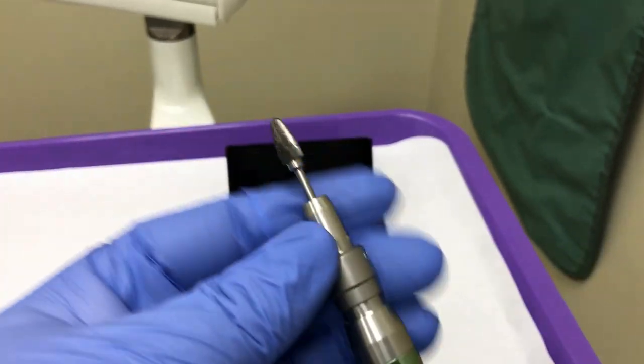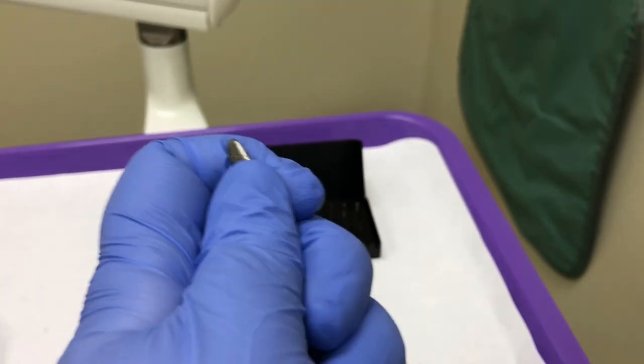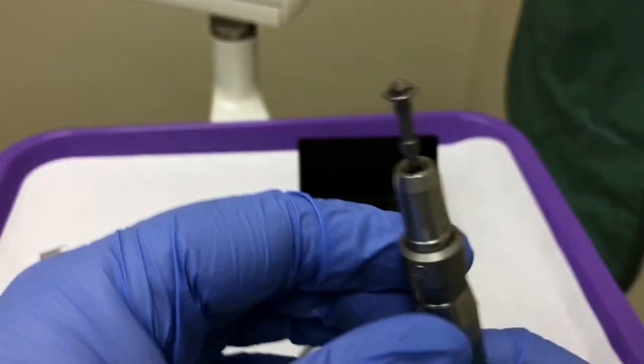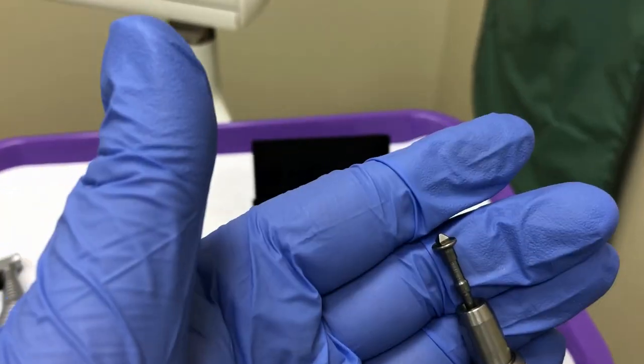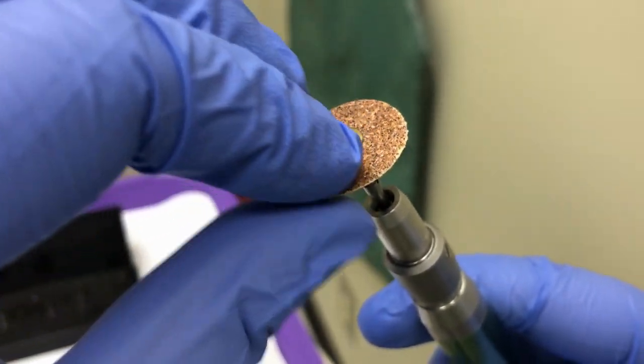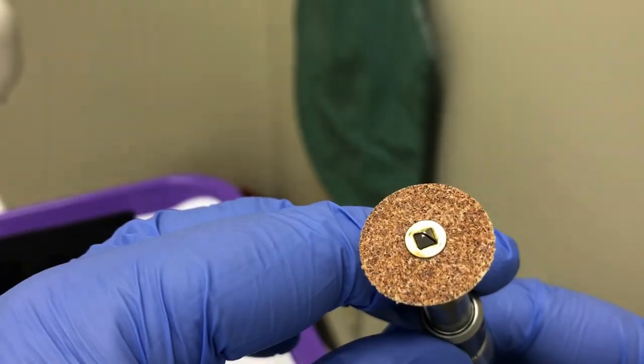Unlock the handpiece and remove the burr and insert the mandrel. Lock the mandrel in place and attach a sandpaper disc. Now the low-speed handpiece is ready to be used with the mandrel and sandpaper disc.